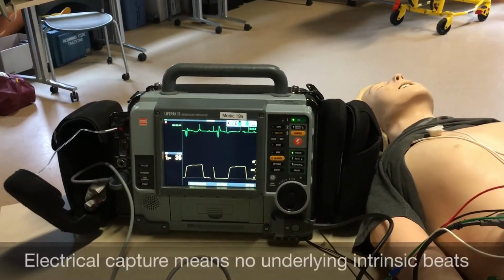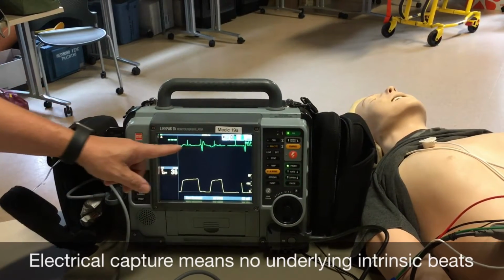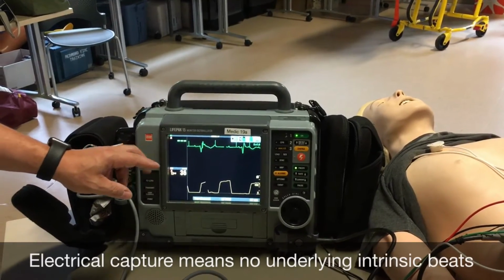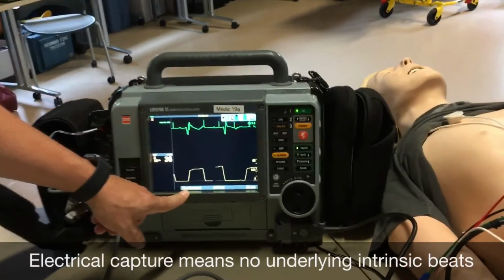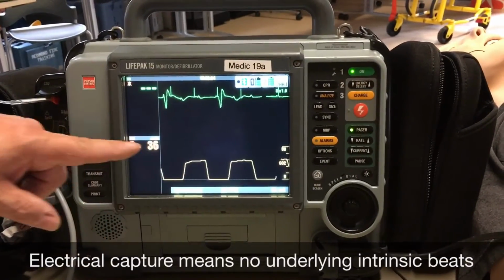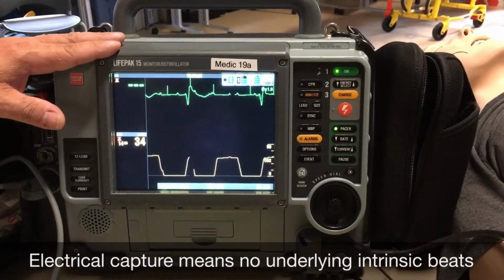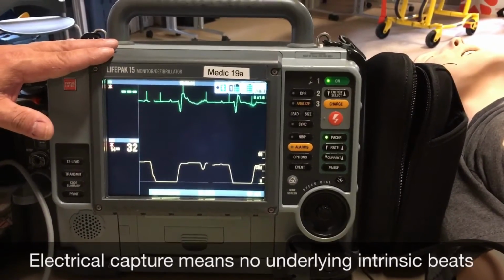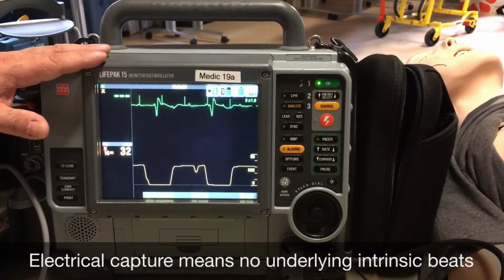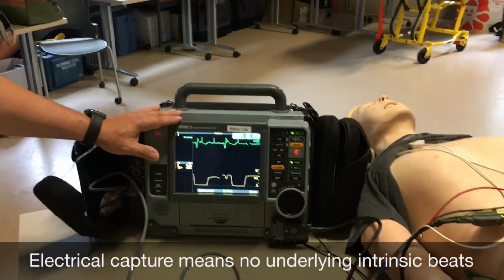So now that we have the pacer on and we can see pacer spikes and we don't have capture, the first thing we need to remember is that in non-demand pacing, which is what we use out in the field, the only way that you know that you have capture electrically on the monitor is when the rhythm is completely taken over by the pacer and there are no underlying intrinsic beats. So if you're looking at a rhythm and you see the underlying rhythm in it while you're trying to pace, you do not have capture.